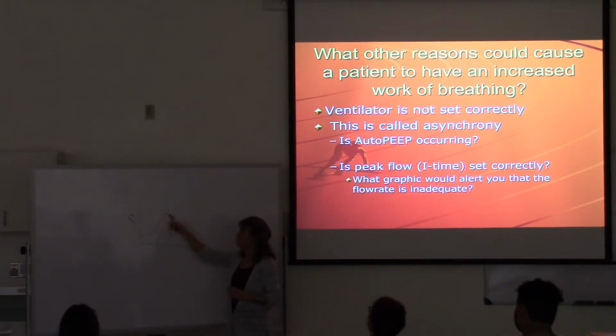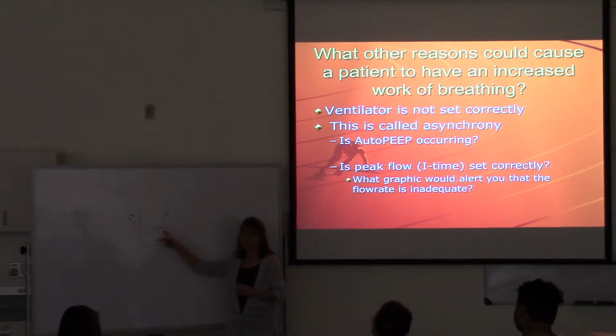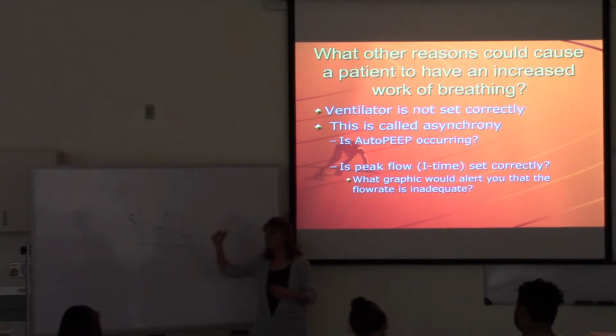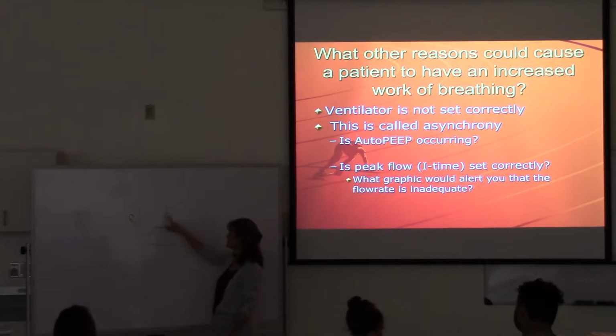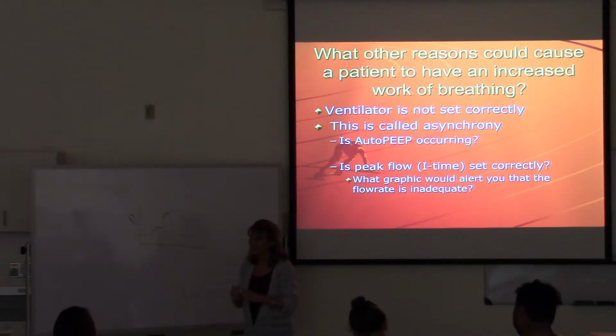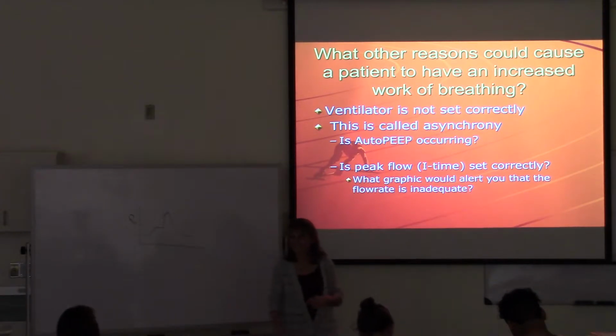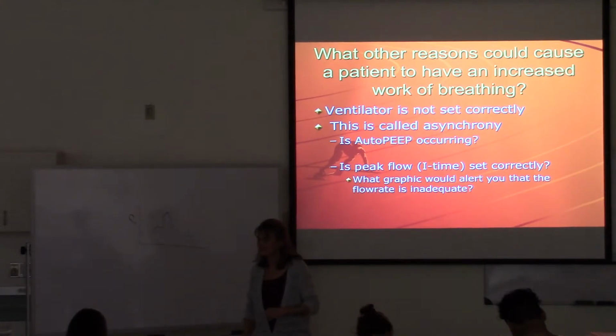But if you don't have enough flow, then the pressure will kind of sag or lag behind, and you'll get something like that, where instead of a smooth rise to inspiratory pressure, the pressure won't build. Pressure will not build adequately, because there's not enough flow.